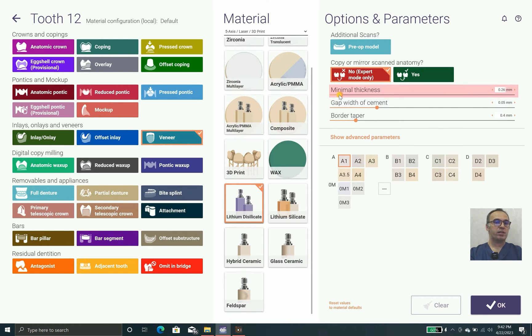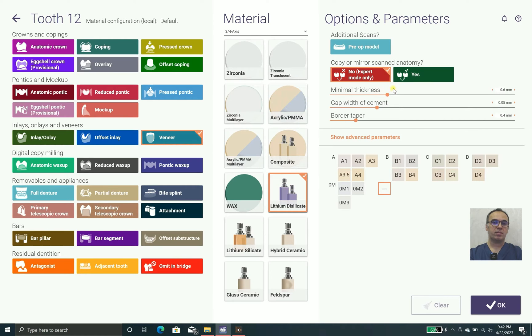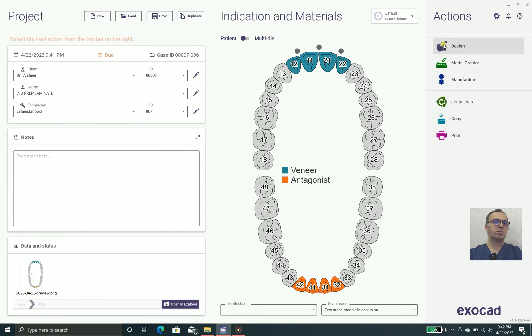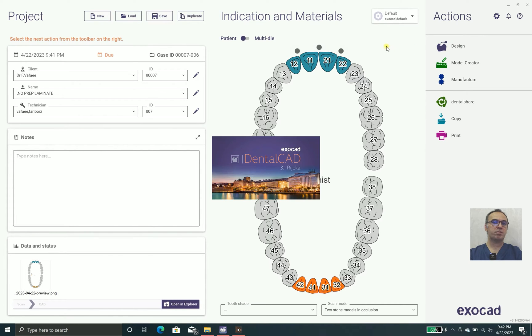I myself prefer minimally prepped laminates, but sometimes the patient doesn't allow you to shave the teeth. In that case, we use non-prep laminates. We are going to use four-axis milling and lithium disilicate, putting the minimum thickness to the least amount that our milling machine or printer can produce — between 0.2 and 0.3 millimeters. I prefer 0.3.